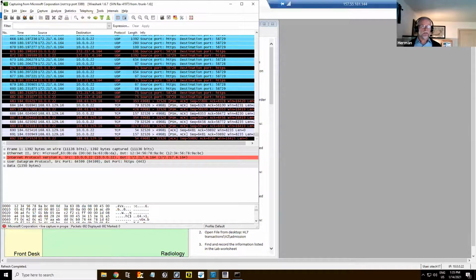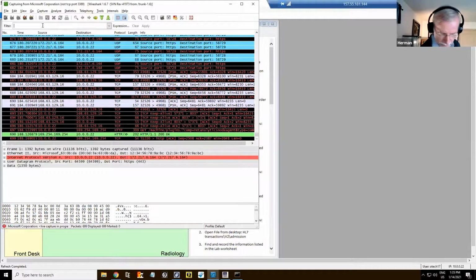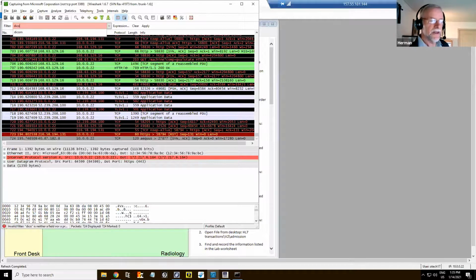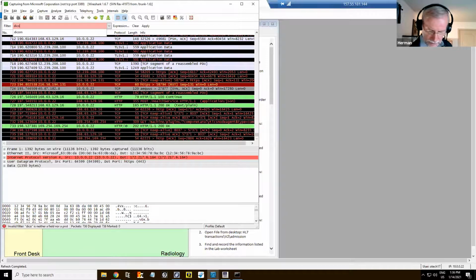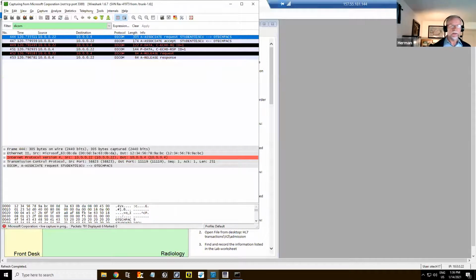Okay, so still listening, but I did my DICOM. So basically what I do, I go to my filter at the top, and I type in DICOM, D-I-C-O-M. The good news is that if you type in the wrong name, see it's red, so it will recognize lowercase dicom, and then enter. See? Oh, super cool. So what do we have? Now remember what I talked about earlier. There should be 3 phases, 3 steps: open an association, do the job, and release.